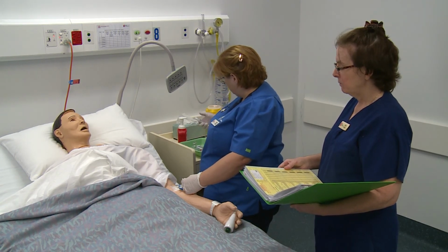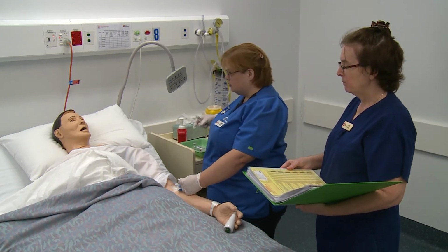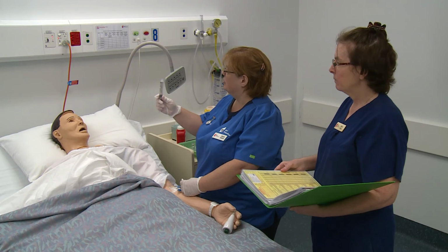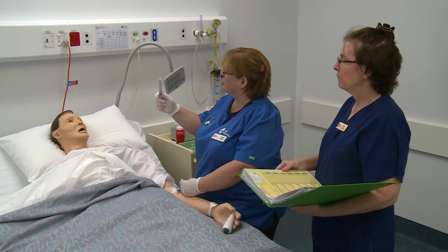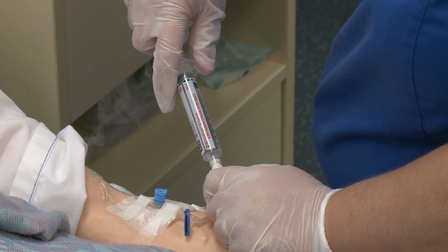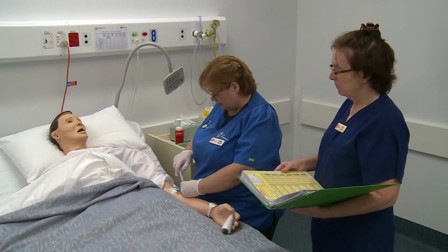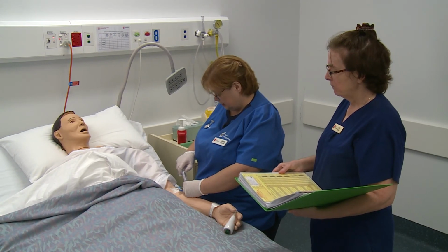Okay, now I'm just going to flush that medication through. If I thought I'd contaminated your cannula hub while I was swapping, I would decontaminate it again by cleaning it with the alcohol wipe. So just checking for air bubble, no air bubble, and connect up. And I'm just going to flush my medication. I'm going to flush a little bit slower than previously because of the medication that's in this line. But ultimately you're aiming for 30 seconds to flush. And that's all going in nicely.